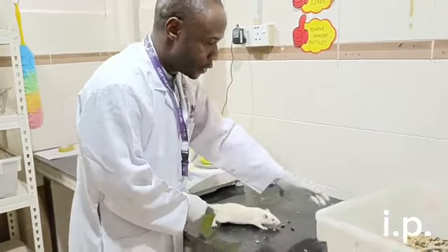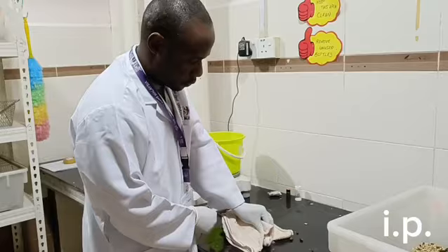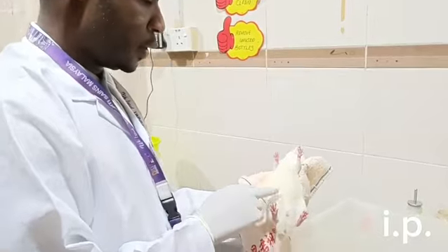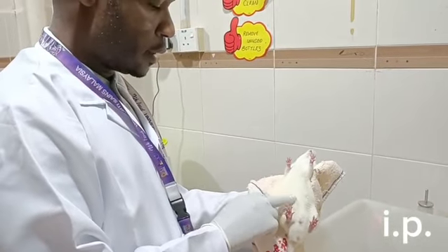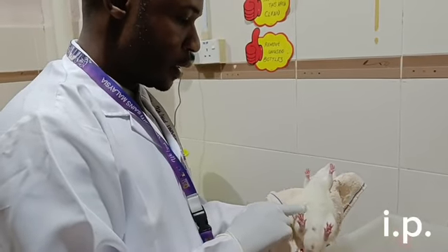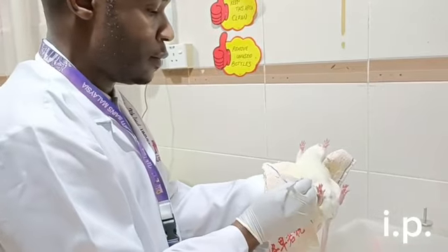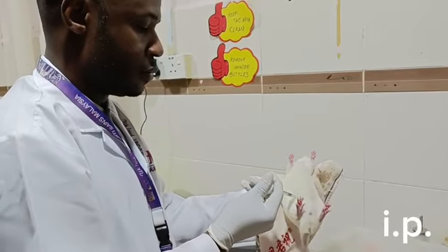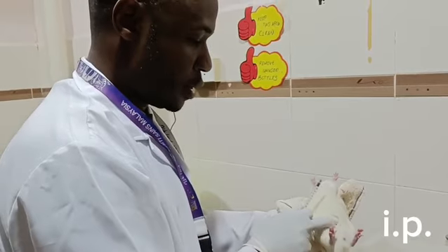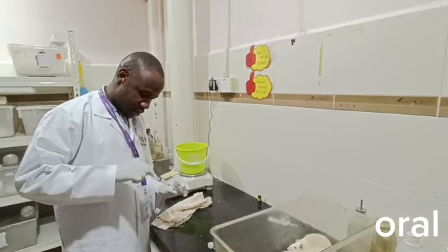The animal is very friendly to you, so you try to hold the animal. So we now try to see the lower quadrant, but the right part is most preferable, because you want to avoid organs like the liver and spleen. So that's that for the IP administration to the right. Then oral administration, using oral gavage.